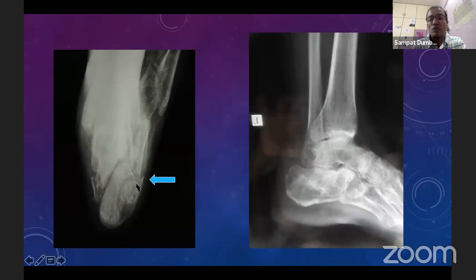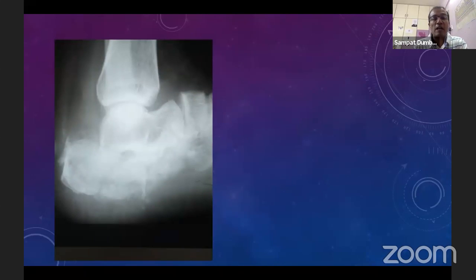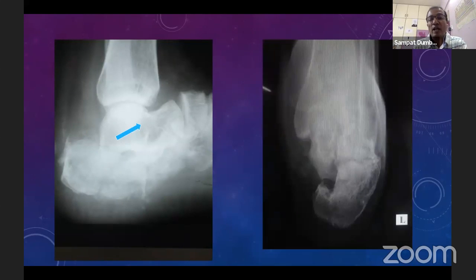And of course, the joint arthritis. So we have got all the responsibility apart from reconstructing the joint. So much of the biomechanics, like axial alignment, height, width, and length of the calcaneum, has to be maintained. So you take an approach which is soft tissue respecting, but it should reconstruct the biomechanics. Like in this case, it is a dorsiflexed talus, which is not good for ankle movements. And this malunion is causing some tarsal tunnel syndrome.